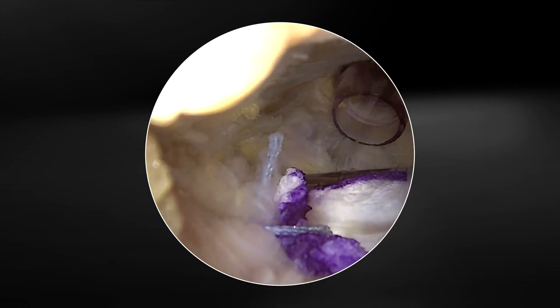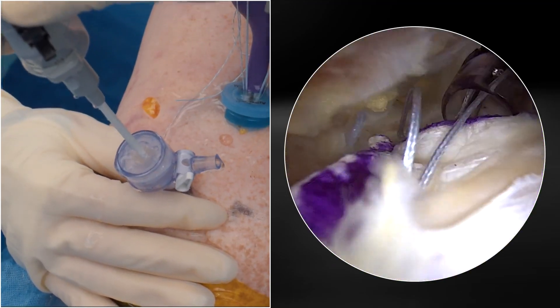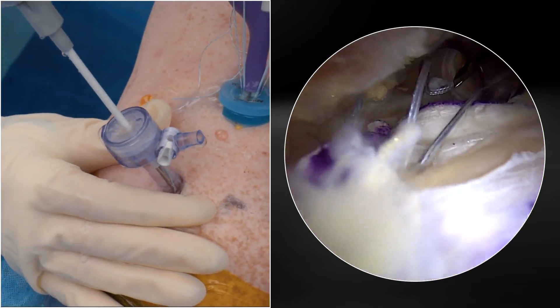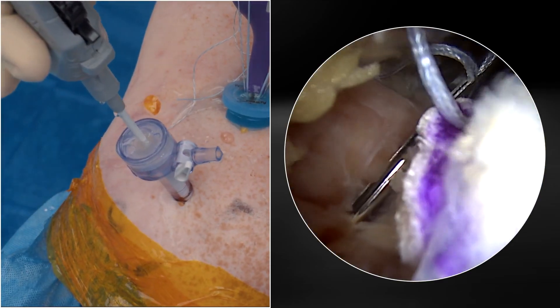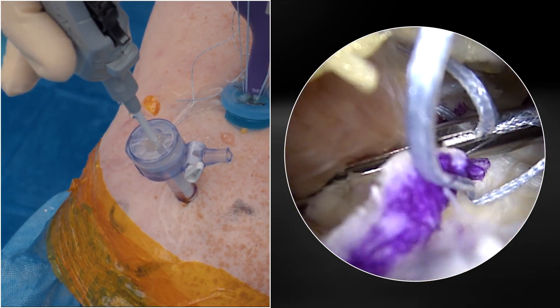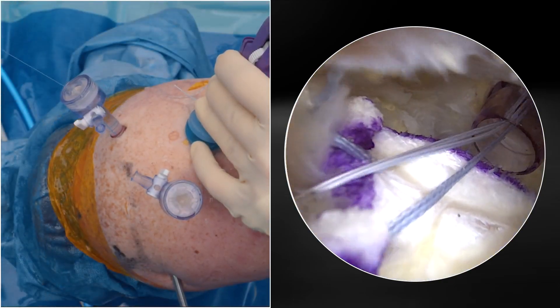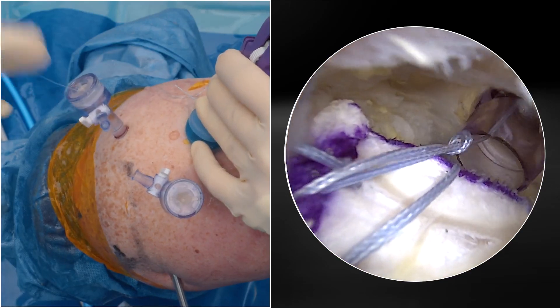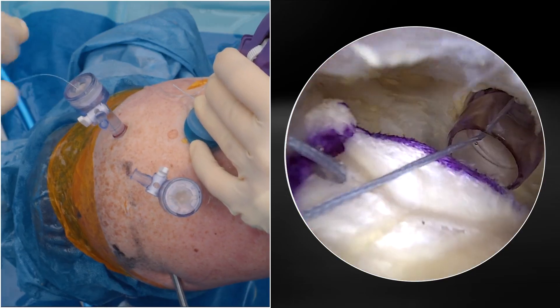We're now going to repeat that step for our second fiber stitch. I back this out and simply come over the top of the patch again, coming just over the top so I can secure a medial stitch right over the top on the other end. Once I feel like I've got that patch down, I simply bring the other limb of the mattress suture into place and it will cinch that down completely.